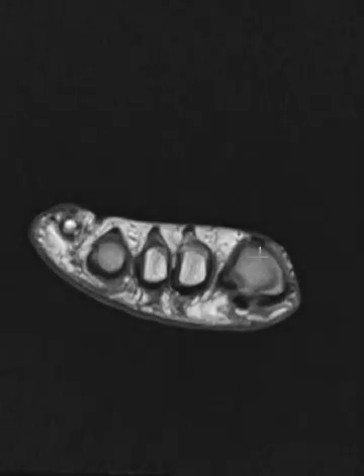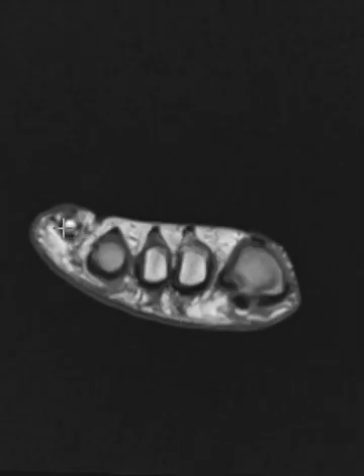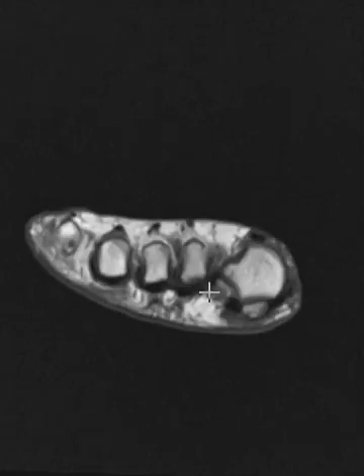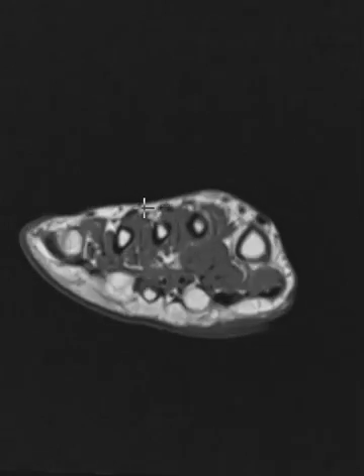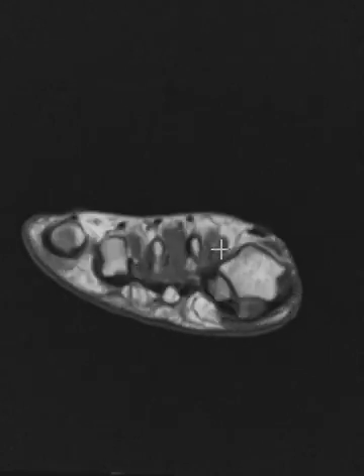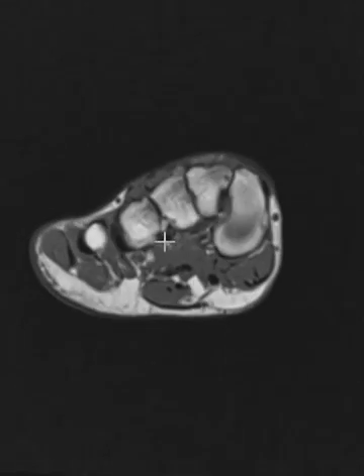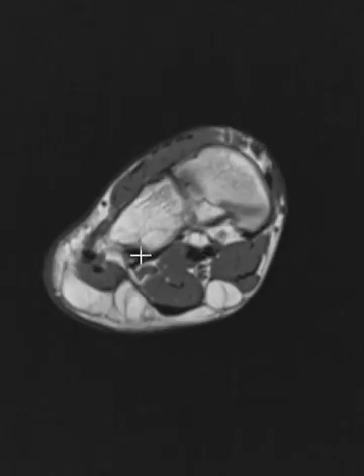This is a short axis view, and now we can see the metatarsal heads. These are those two sesamoid bones — the medial sesamoid and lateral sesamoid. We can see the second, third, fourth metatarsal heads and the fifth metatarsal bone. We can see these bands along the bottom — these are those plantar plates; we want to make sure they're nice and clean and intact. We can also see the tendons: the flexor tendons, these dark bands. The flexor tendons when they contract make the toes pull downwards. These little ones along the top are the extensor tendons of the toes — very small, hard to see. All the tendons here look good. The gray here is all muscle — dorsal muscles and plantar muscles of the foot. You can see these thickenings that are dark; these are the tendons.